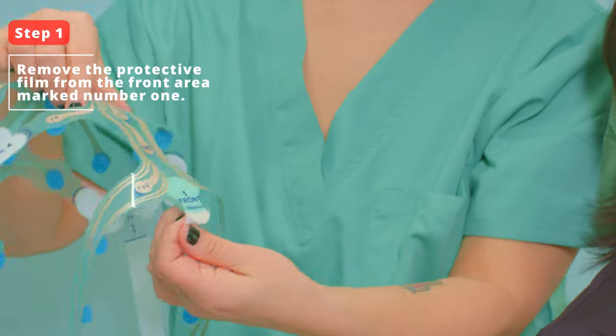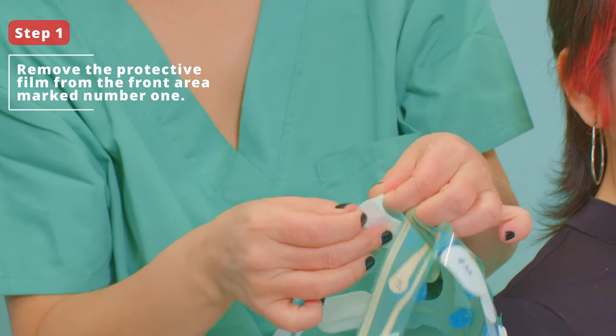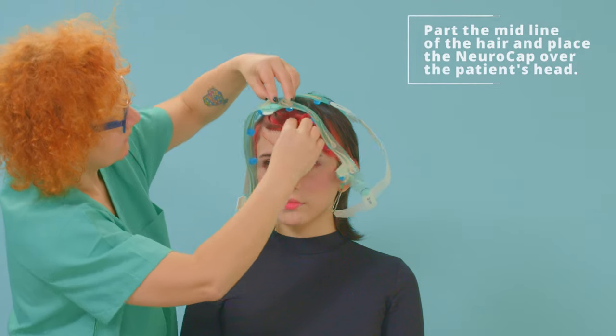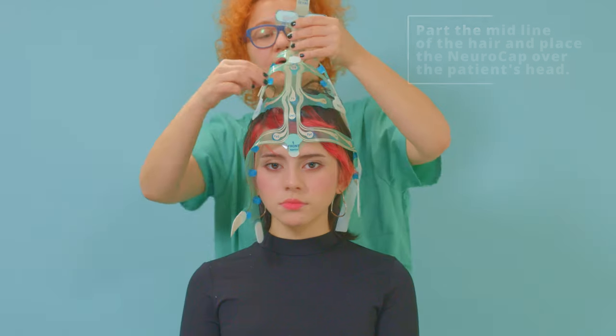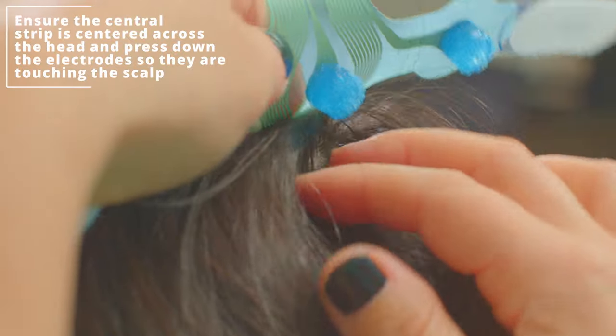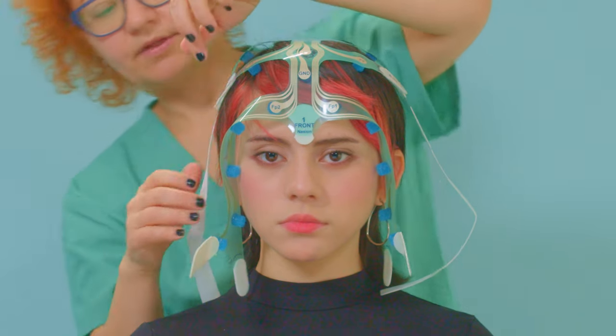Step 1. Remove the protective film from the front area marked as number 1. Part the midline of the hair and place the NeroCap over the patient's head. Ensure that the central strip is centered across the head and the electrode sponges are touching the scalp. While applying, slightly press down the electrodes.